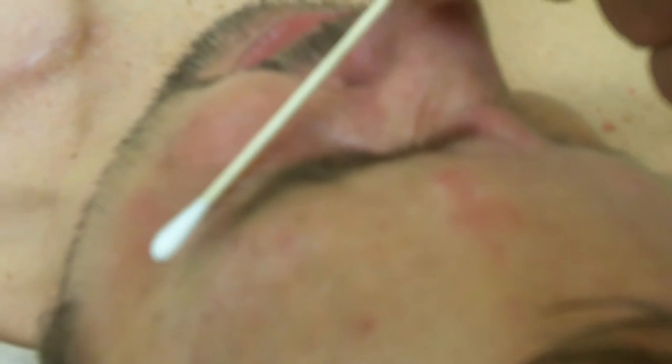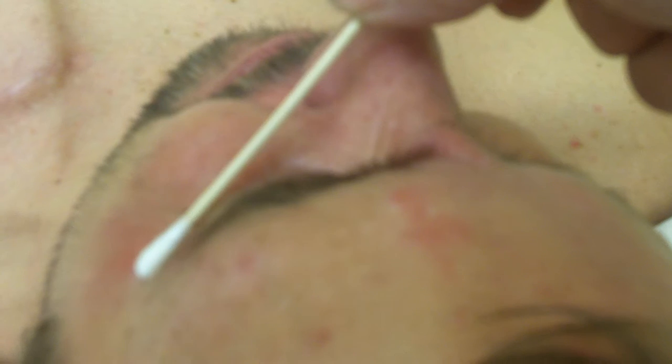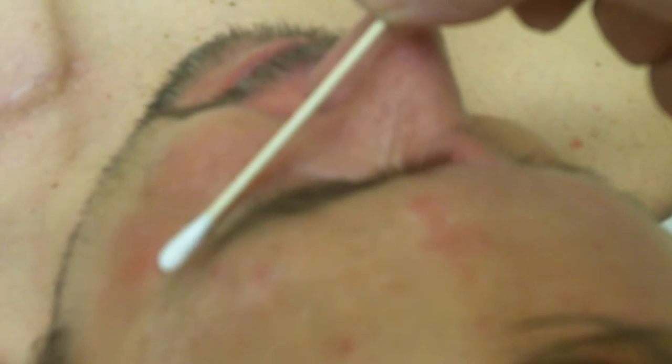Breathe. Good job. You may have some raised areas. That swelling should go down by the time you get ready to leave the clinic. One, two, three. Breathe, breathe, breathe. I know there's pressure. Hang in there. Good job, Tom.